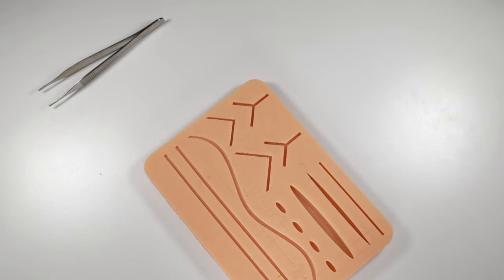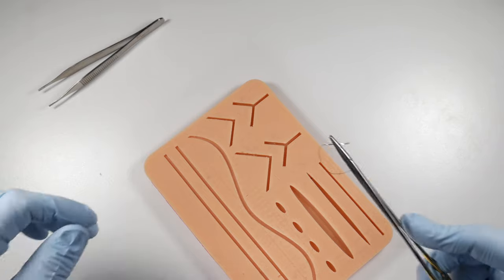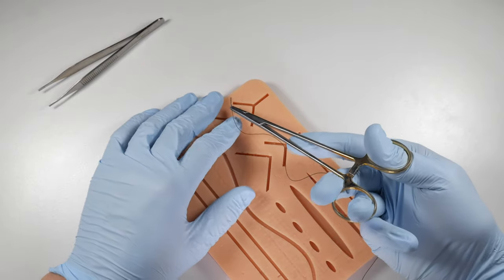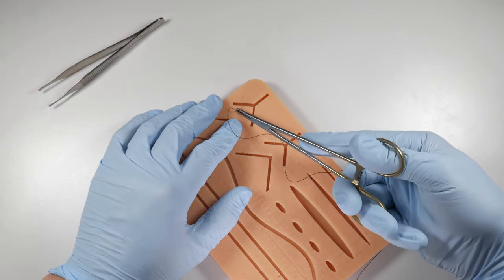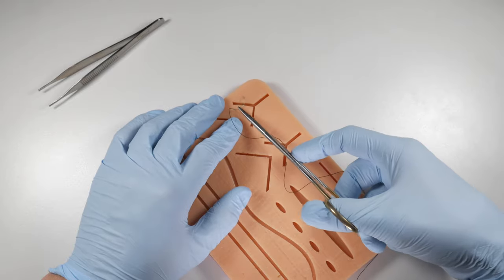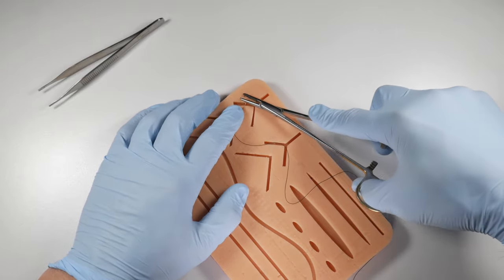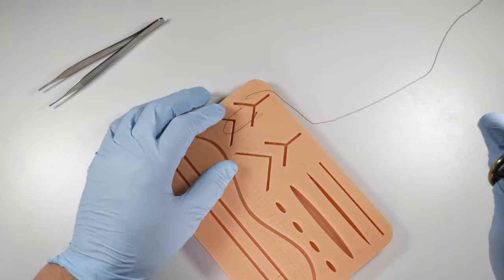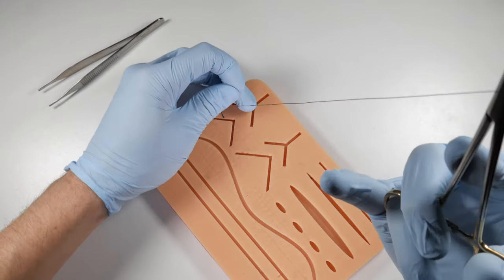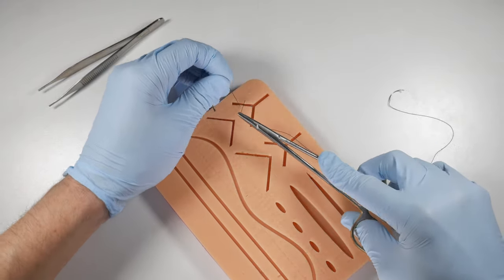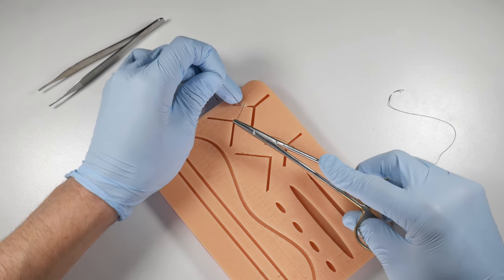If you take proper bites, say that you take proper bites that are about maybe three millimeters from the tissue edges, then you're going to have a better chance of everting the tissues when things are approximated. So if you pull this through at the proper distance when you go to close this up, you're going to find that the tissues come together very nicely and the tissue edges kind of stand up a little bit.